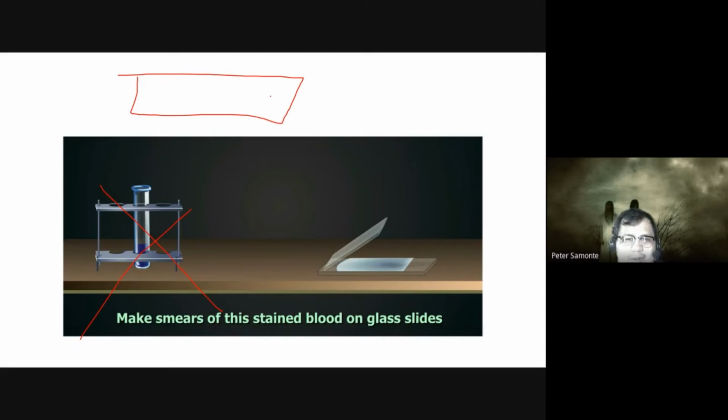Ang ituturo sa inyo, kuha kayo ng slide. Name ng patient, label. You're going to get a drop of blood and a drop of new methylene blue. Ihahalo niyo yan. After mixing, gagawa na kayo ng smear. Ito ang tinuro sa akin nung internship ko, ito ang tinuturo sa mga hospitals.